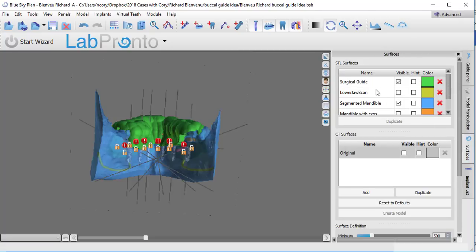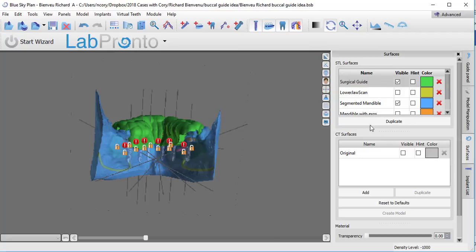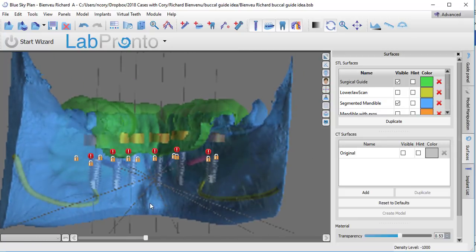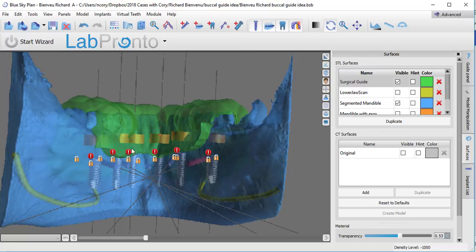And we also need to now turn the transparency down on the green guide and the jaw. We need to be able to see what's going on underneath those. So the jaw is already made transparent. We're just going to do that to the guide as well. So now what you're seeing is the guide tubes and the implants underneath, and this is going to help us determine where to make these bone cuts.